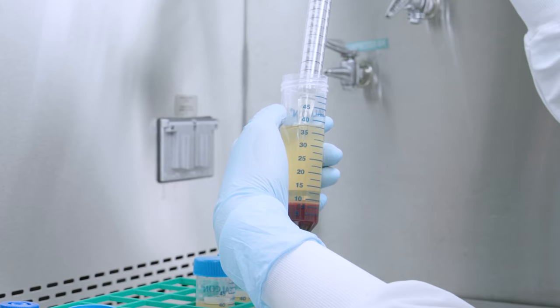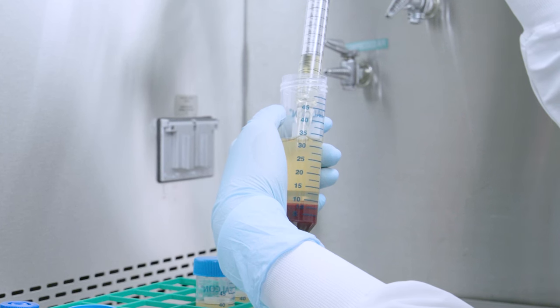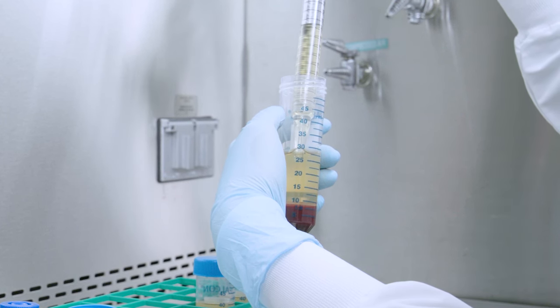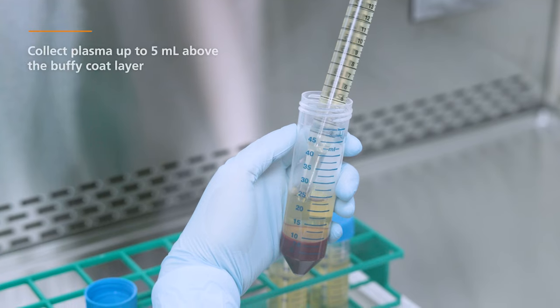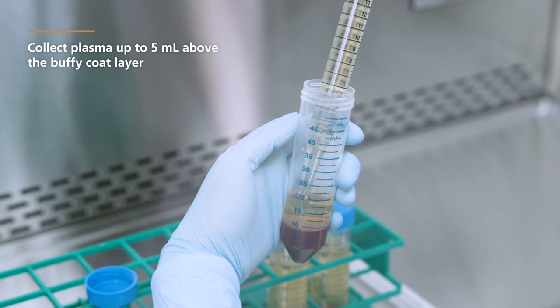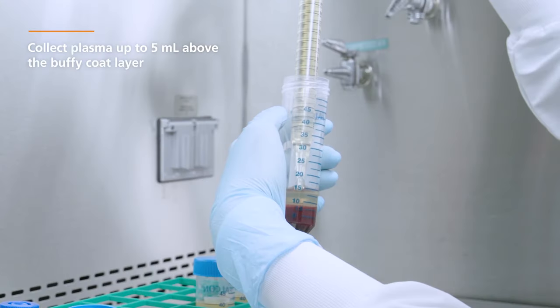After centrifugation, carefully remove some of the plasma layer. Here, you can use a 25 mL serological pipette to collect plasma up to 5 mL above the Buffy Coat layer.